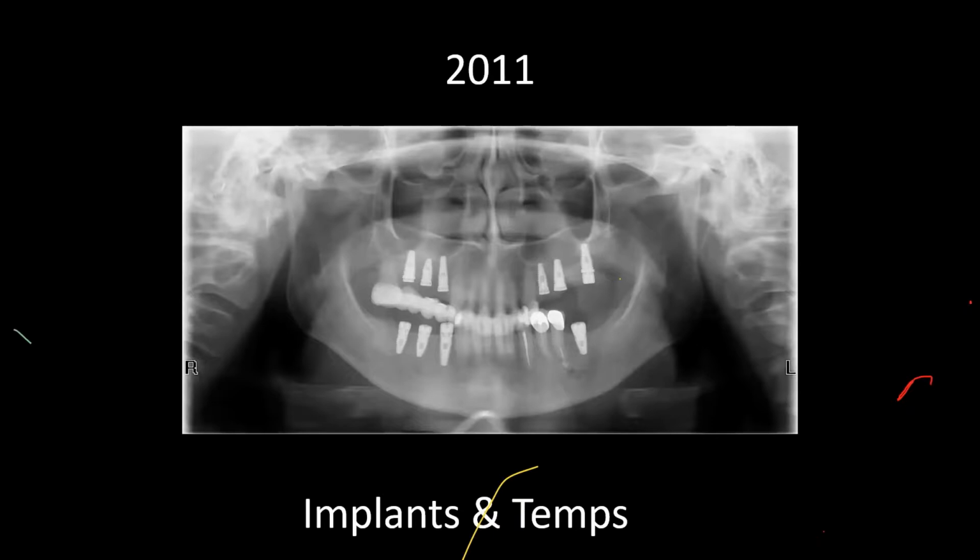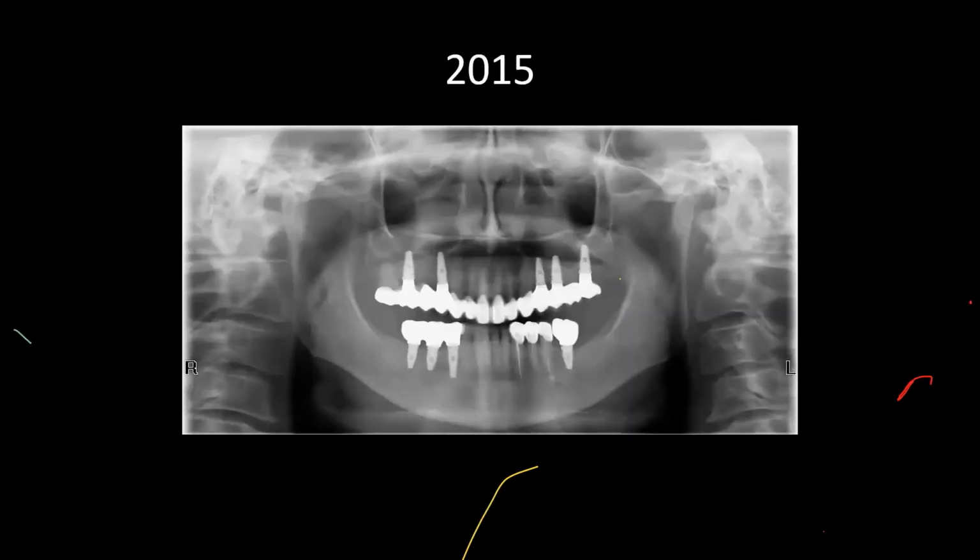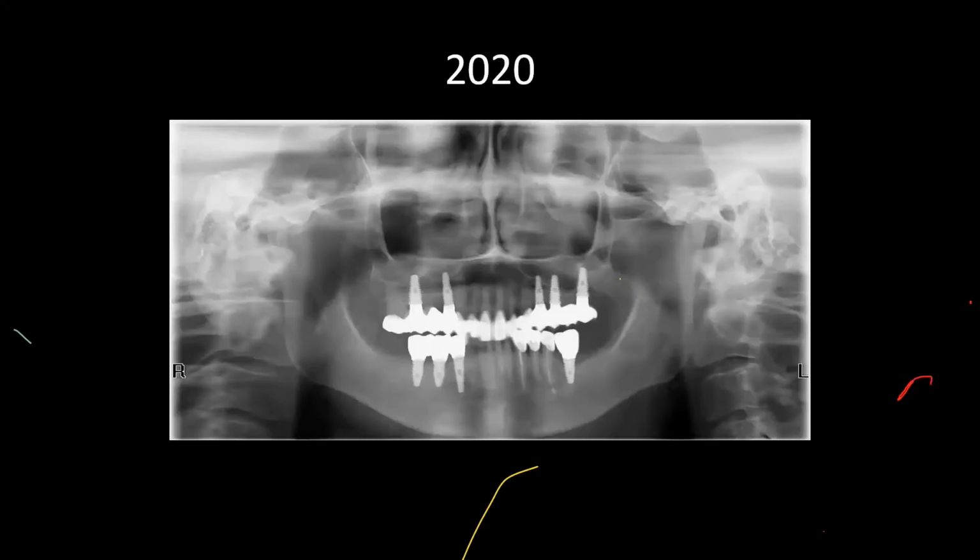Oh, sorry, 2011. Well, I can see some changes on the right mandible, but I'm going to keep going. I'm going to take X-rays. That's 2015. Okay. There's a joint remodeling. Okay, that's called adaptation. Sorry. Oh, okay, it's remodeling.